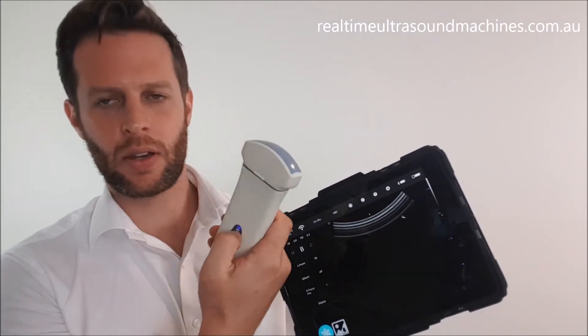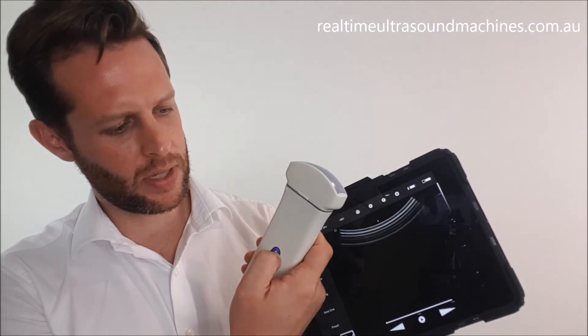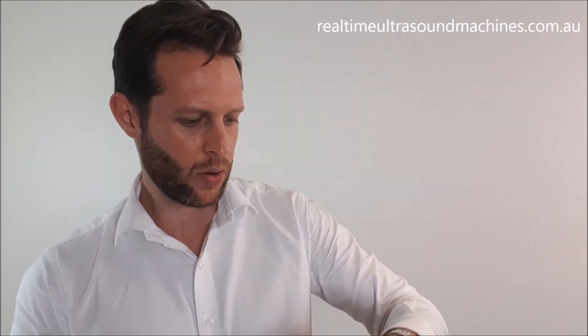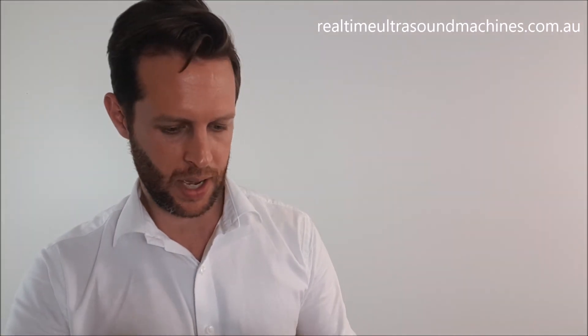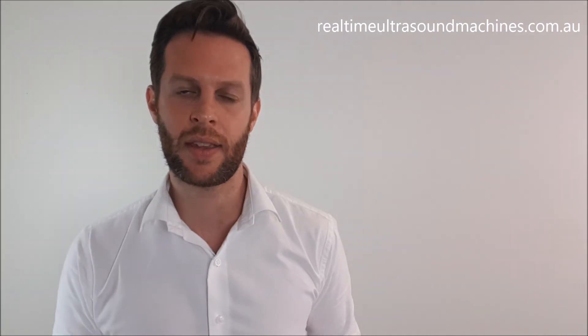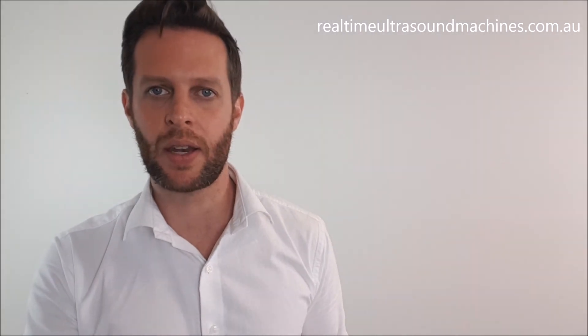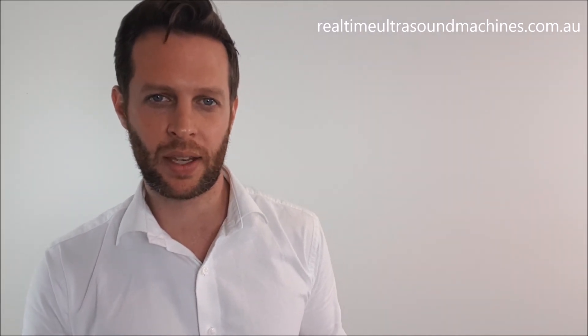If you ever need to restart or reconnect, the best thing to do is turn off the ultrasound itself so the iPad isn't trying to connect to anything. Double-tap the home screen and slide it away. I recommend turning off the ultrasound and shutting down the app when you're not using it, especially if it's going to be a long time between patients, because the iPad or ultrasound machine can start to go to sleep and then have trouble connecting again. Best thing to do: switch off the device when you're not using it, switch off the iPad, and put them away - it only takes 30 seconds to boot up again next time.